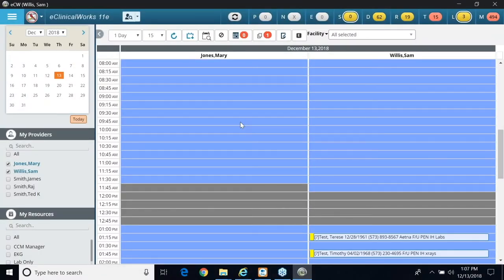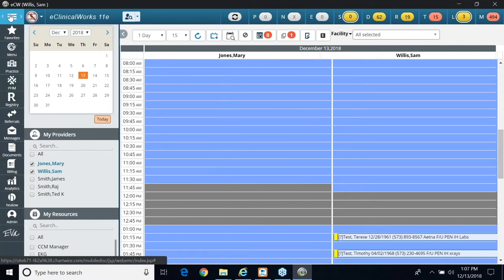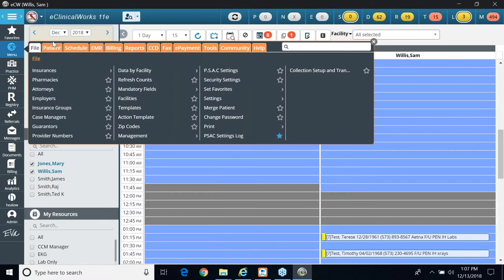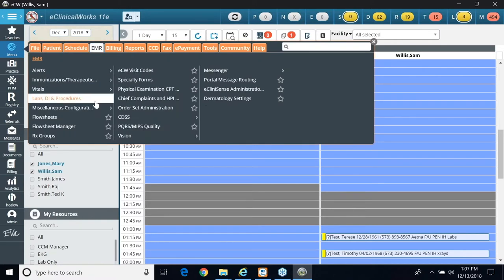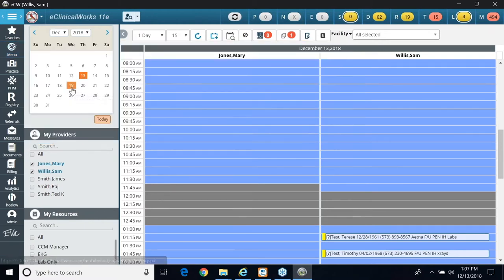I'm going to show you now how to set up in-house diagnostic imaging tests. If I click on the parallel bar, I click on menu, I click on file, then I'm going to click on EMR, labs, DI procedures, and then I'm going to click on diagnostic imaging.